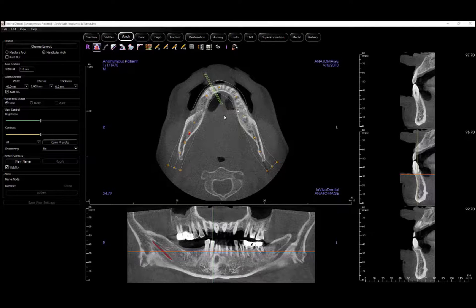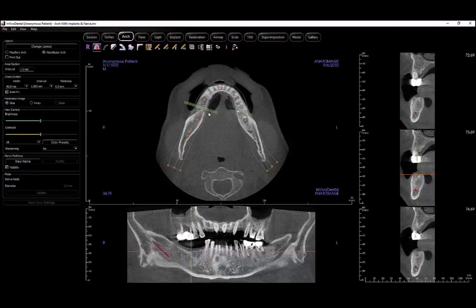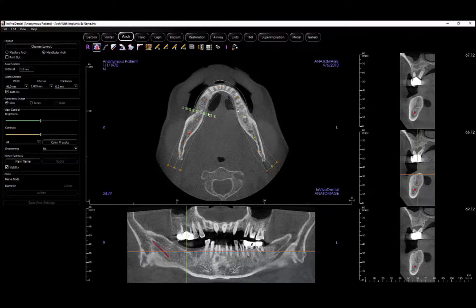The arch section tab can also be used to view anatomy in multiple cross sections traversing the dental arch. When doing so, first make sure that the arch spline is parallel to the arch at the area of interest and adjust if necessary. This means that the green cursor lines will be perpendicular to the arch, which ensures the cross sections are buccal-lingual at this location. This is crucial to display an accurate amount of bone and to avoid oblique slicing.